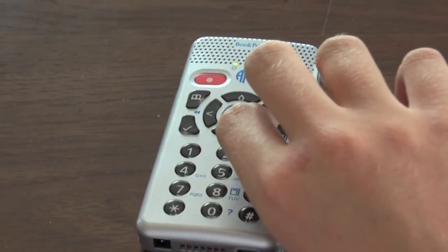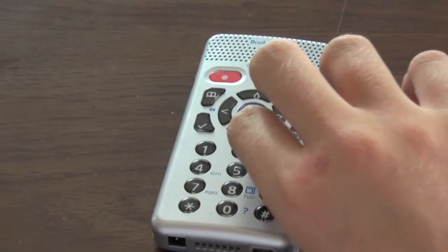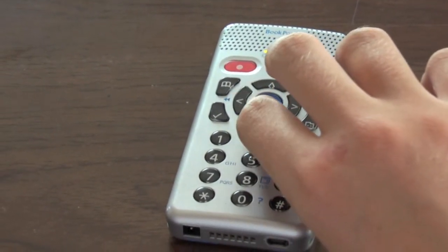Date and time. Here's how you set your date and time. So I want to show you this. So let's go in with down arrow. Enter year. 2012. So we would set the date and time. You would type on the keypad like you would on a phone the year. This is set right, 2012.